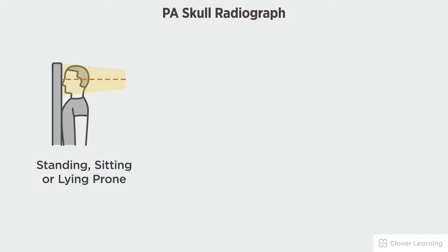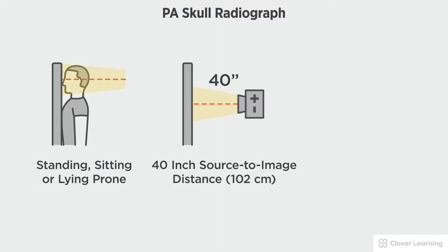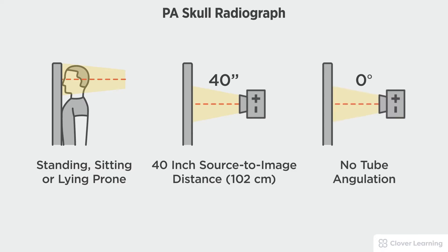In this view we will be demonstrating the PA skull. The PA skull should be performed with the patient standing or sitting at the upright bucky or lying prone on the table with a 40-inch source to image distance and no tube angulation.